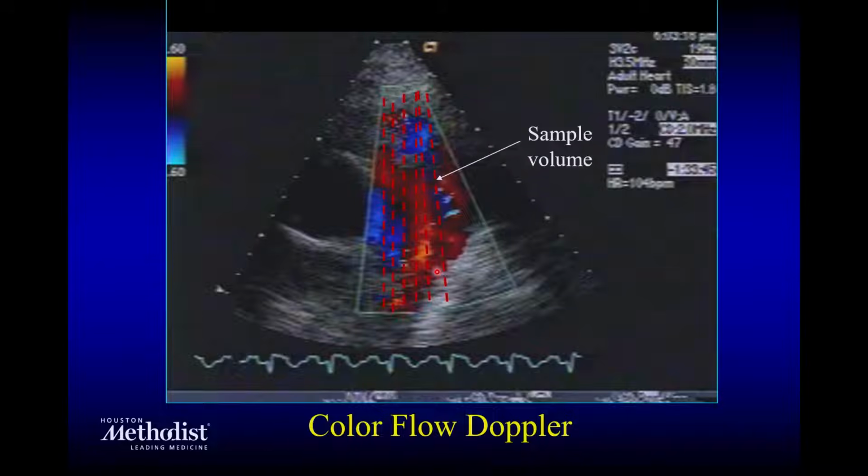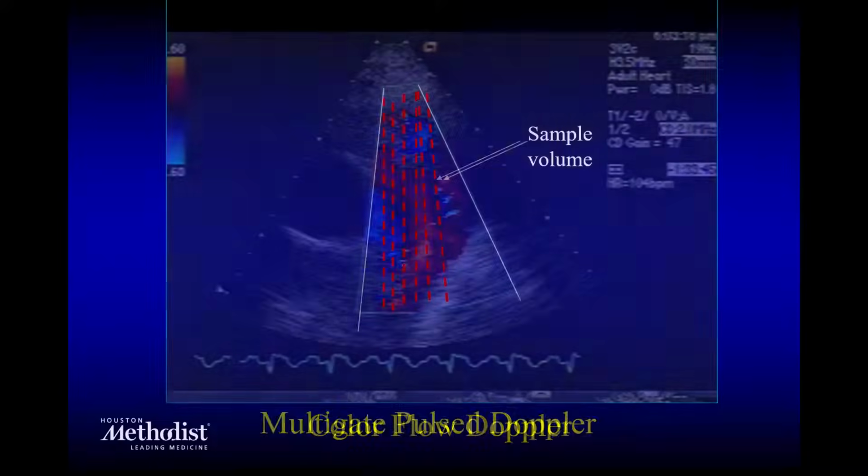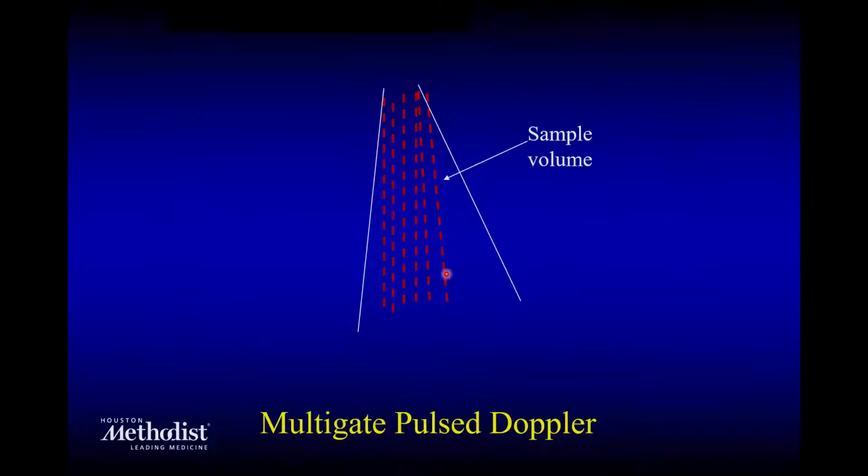For pulse Doppler, we use a fast Fourier transform analysis to get a really nice resolution of what these frequency shifts are. Here it's an autocorrelator, an estimation of the mean velocity, coding it also going away from you in blue, coming towards you in orange. Okay? And the frame rate would be lower, so you have to optimize the frame rate. Otherwise, you're not going to be able to see it well.